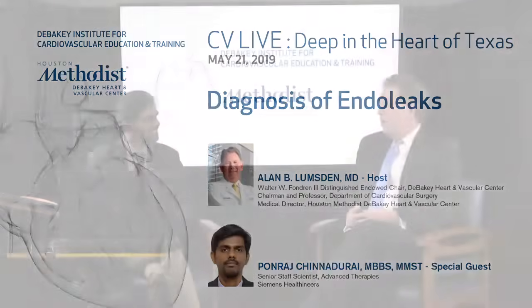This evening I'm joined by my friend and colleague, Dr. Ponraj Chinnadurai. He is one of the senior research scientists for Siemens Advanced Therapies. He's taught me a lot about how I think about imaging and how we integrate preoperative imaging into actual therapy for the patient. And so tonight we're going to bring what he's taught me to you, and hopefully we can teach you something. So if I could have my first slide, please.